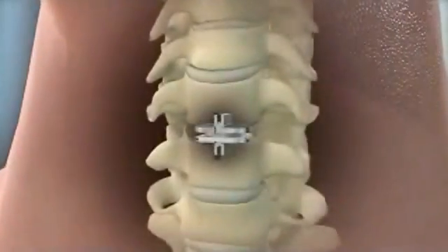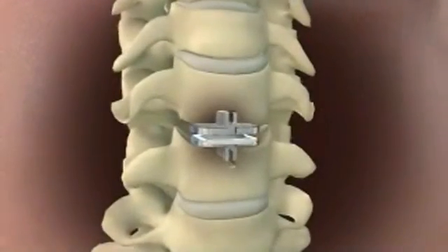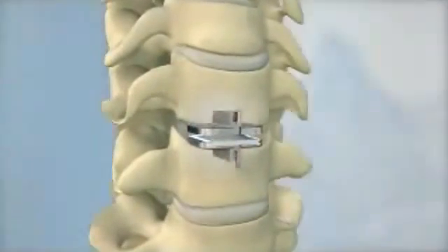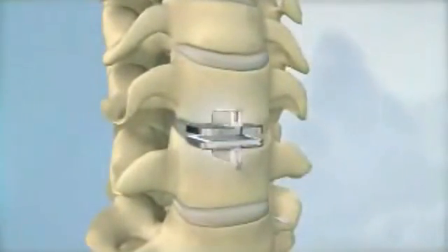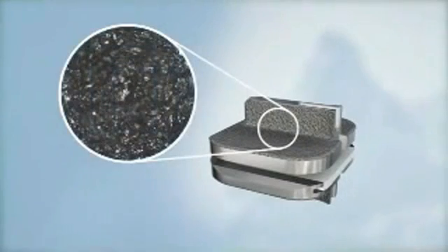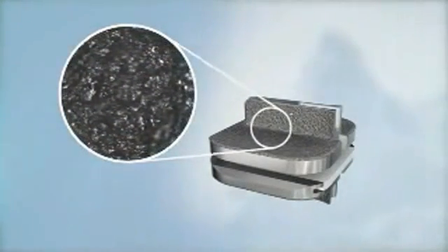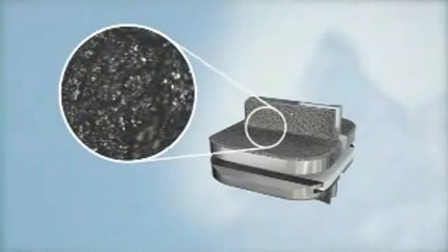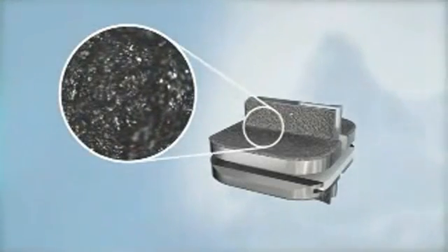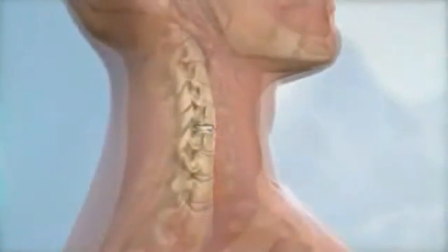The ProDisc-C implant is secured to the vertebral bodies above and below the disc space and held in place with two central keels. All bone contacting surfaces of the ProDisc-C implant have a plasma sprayed titanium coating to promote bony ongrowth, providing long-term implant stability. The ProDisc-C is a zero profile implant that does not contact soft tissue structures after it is implanted.